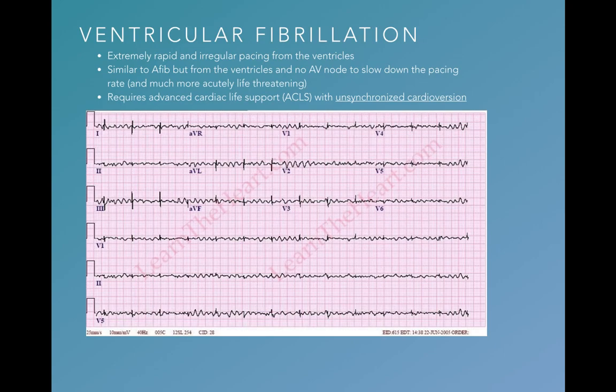So it's important to treat ventricular tachycardia. In ventricular fibrillation, you treat with an unsynchronized cardioversion, meaning you shock the patient. Unsynchronized means that the machine, the defibrillator, does not sync to the R waves because there are no R waves to sync. If someone's in ventricular tachycardia, then it's synchronized cardioversion. So that's another good test question and also important for saving lives.